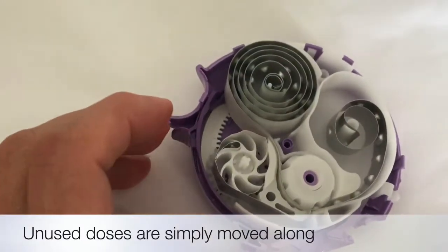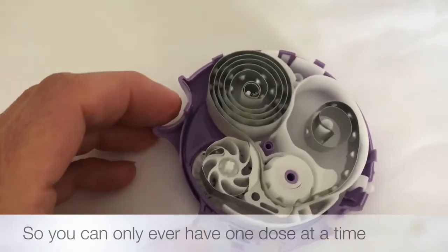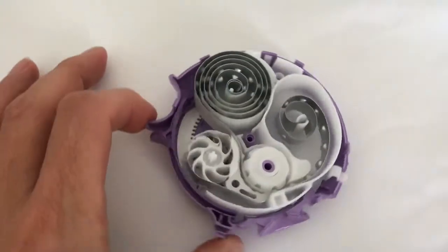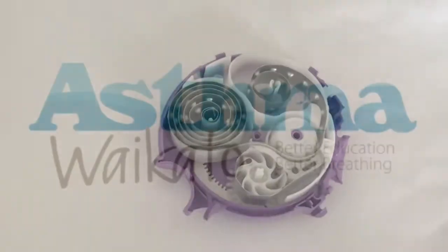We can only ever have one dose of these, because if a dose isn't used and the device is closed, then the next time that lever is pulled it just moves it along. It's a pretty clever little mechanism.